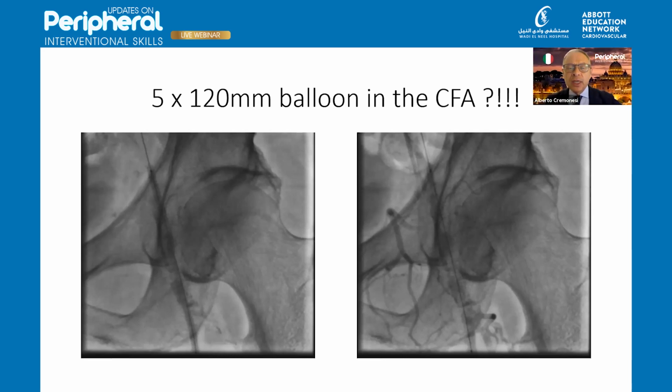And personally, I do agree with you, because we are moving toward vessel preparation. If you consider that there is some thrombotic component, the probability of plaque dislodgement during the procedure, whatever device you use, is so high that you need to find a place to put a filter. And in this case, it's not that easy to find the right place. Exactly. So shall I proceed with the next image?